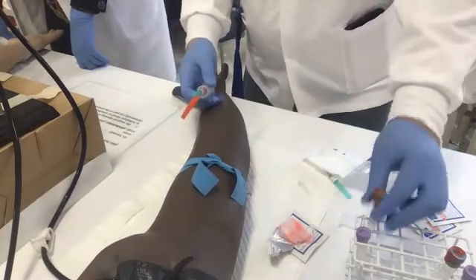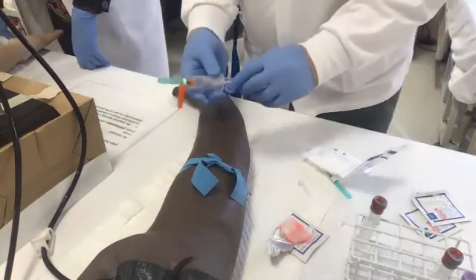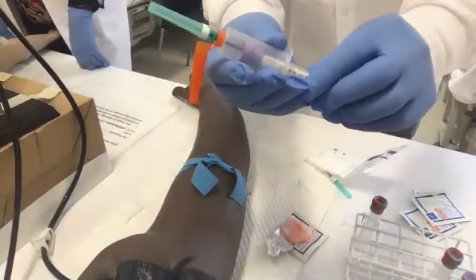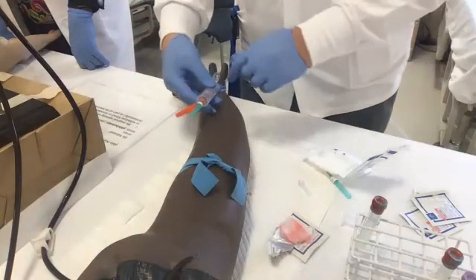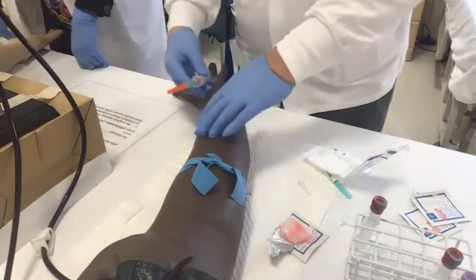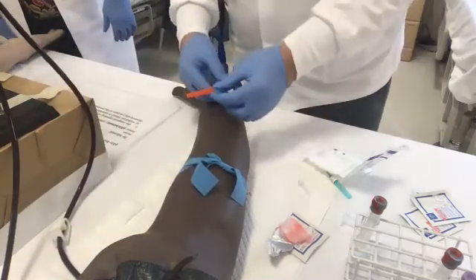What can I do? I get my tube. Who goes first? Lavender. I get my tube first. And do you see how I cradle it? I don't put it all the way in, because if I put it all the way in, it's going to start sucking in air. I only put it all the way in when it's in the vein and when I'm getting blood. So I'm here. Hopefully, well, whether we get blood or not.